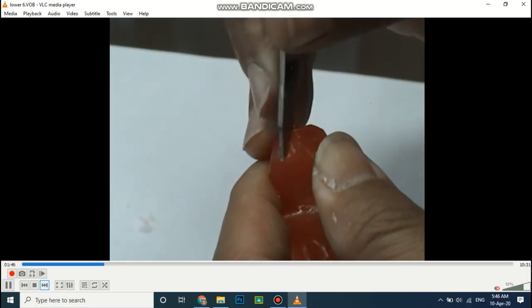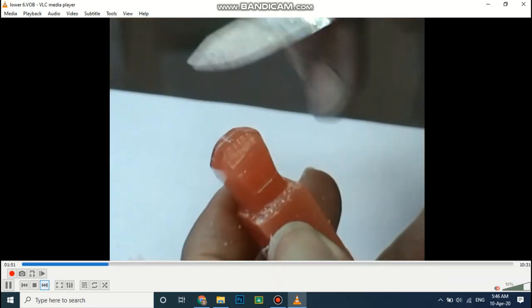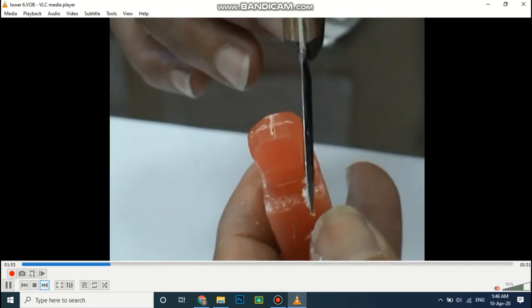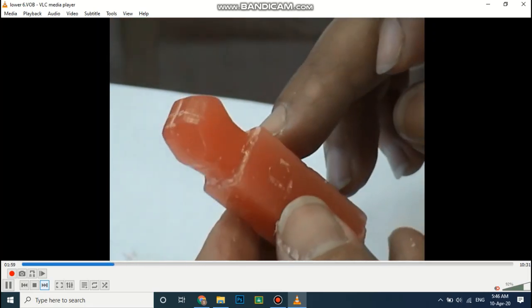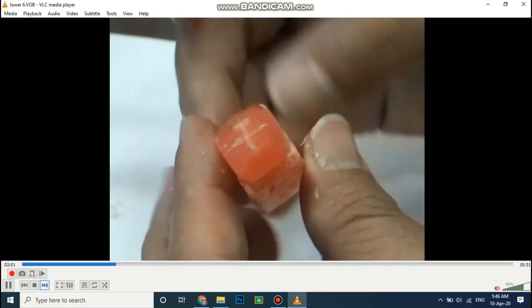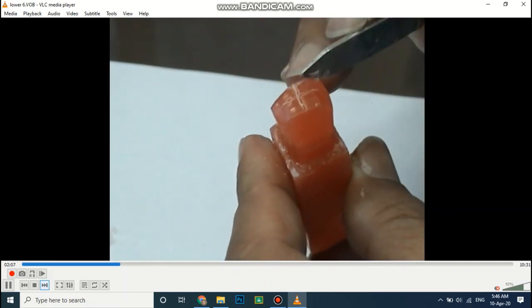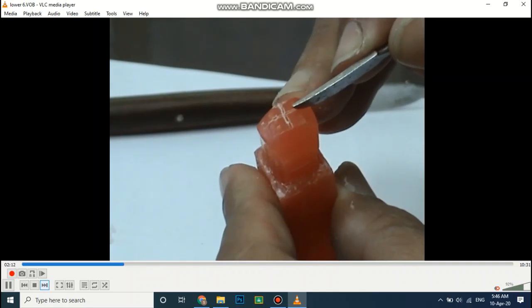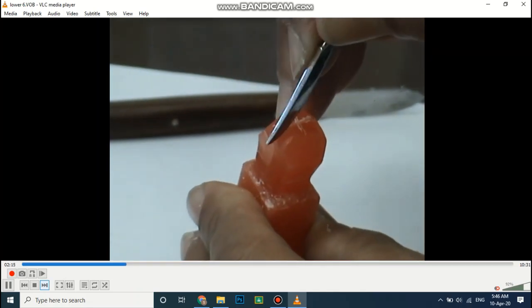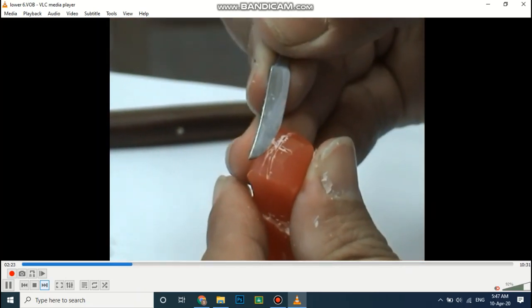Adjustment of the slope should be done. By this way we create 6 surfaces occlusally: 3 buccally, mesial and distal, and 1 lingual. We have to divide the buccal cusps from the lingual cusps, but first we have to adjust the midline. Now the midline is not centralized as we performed distal convergence, thus we have to redraw it again. It should be parallel to the buccal surface, meaning that it's tilted distally to the lingual surface.